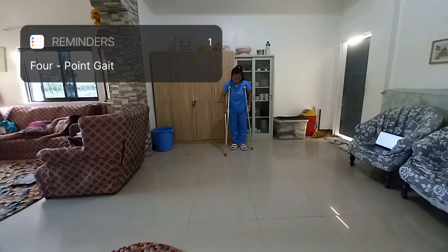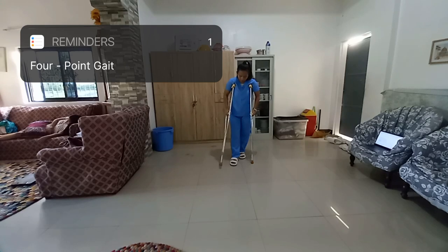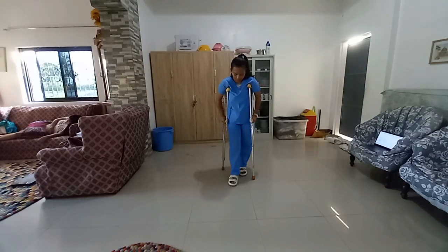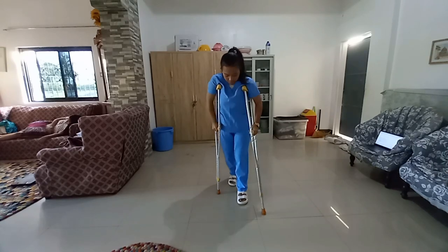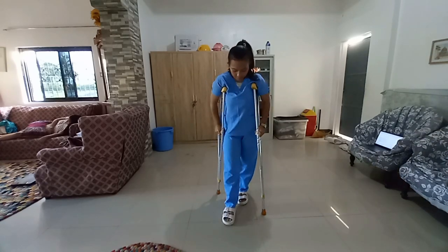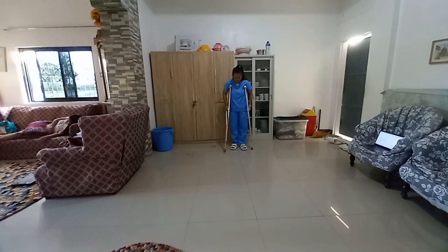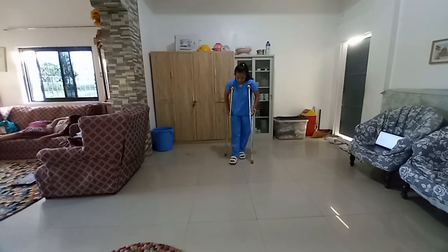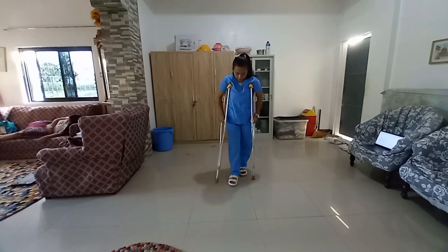For the four-point gait, have the patient move the right crutch forward 12 inches and then move the left foot forward to the level of the right crutch. Then have the patient move the left crutch forward 12 inches and then move the right foot forward to the level of the left crutch.